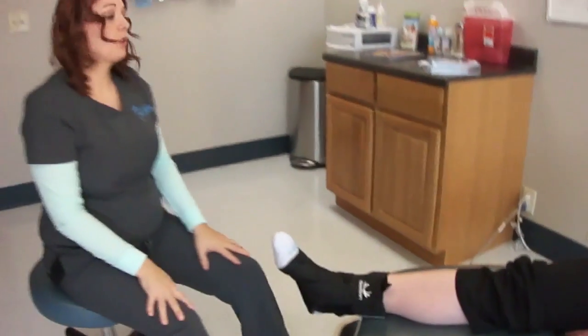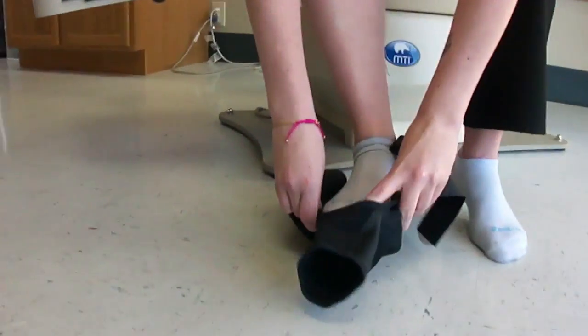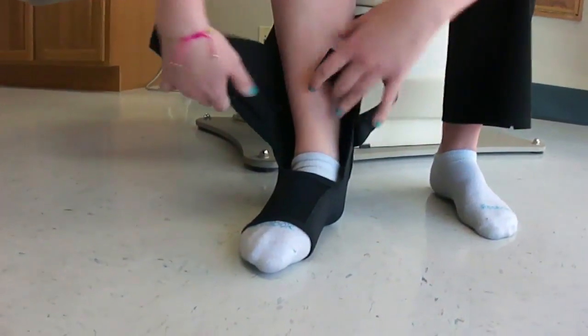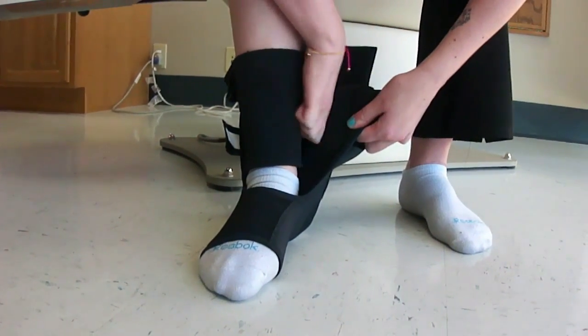Now Charlotte's going to show you how to put it on from a patient standpoint. Hi, this is Charlotte again. I'm going to show you how to put the brace on from the patient standpoint. We're going to slip it on so it goes down into the heel and wrap around to help protect the bone.